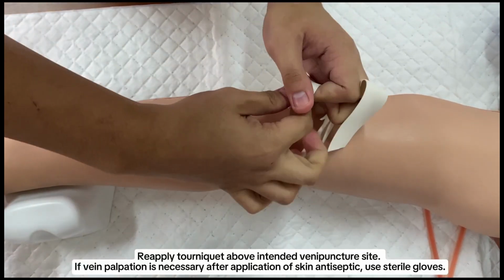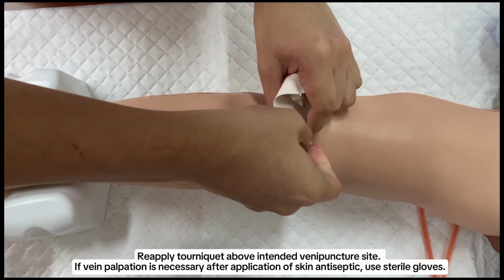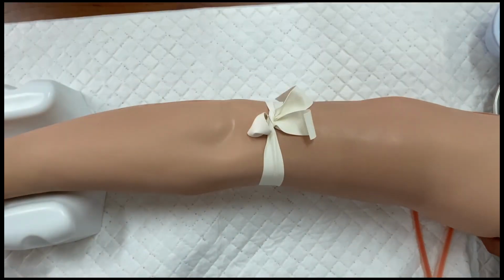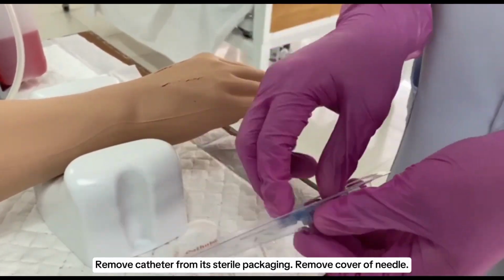Reapply the tourniquet above the intended venipuncture site. If vein palpation is necessary, after the application of skin antiseptic, use sterile gloves. Remove the catheter from its sterile packaging. Remove the cover of the needle.